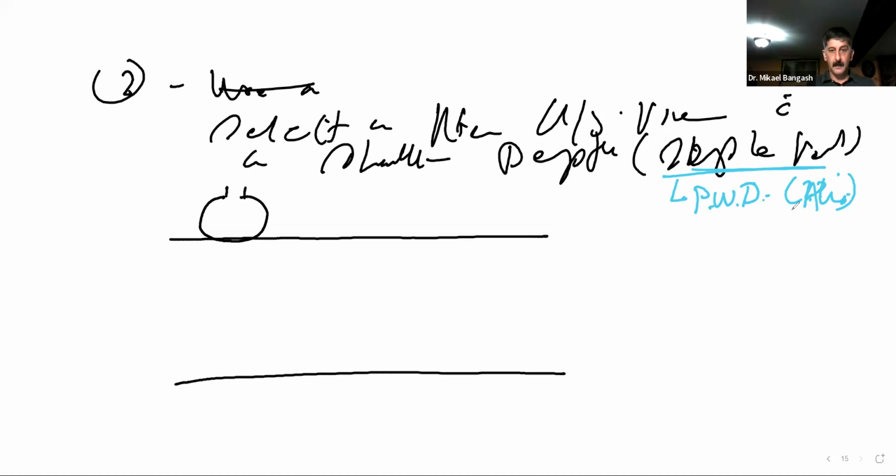Now just keep in mind, ladies, let's put it this way. I said this depth here is mainly due to the angle from which we are scanning. The blood vessel here is at a great depth.